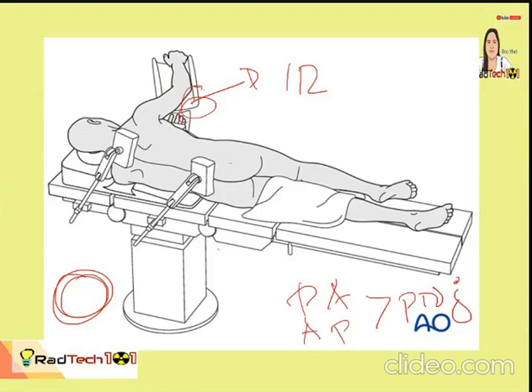The position is just one. So if we are talking of position alone, the patient is in left lateral position. Do you follow? Yes, Doc. Left lateral position.